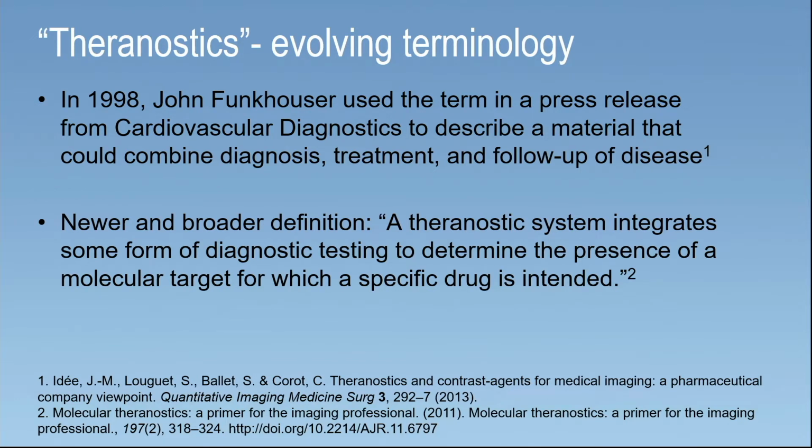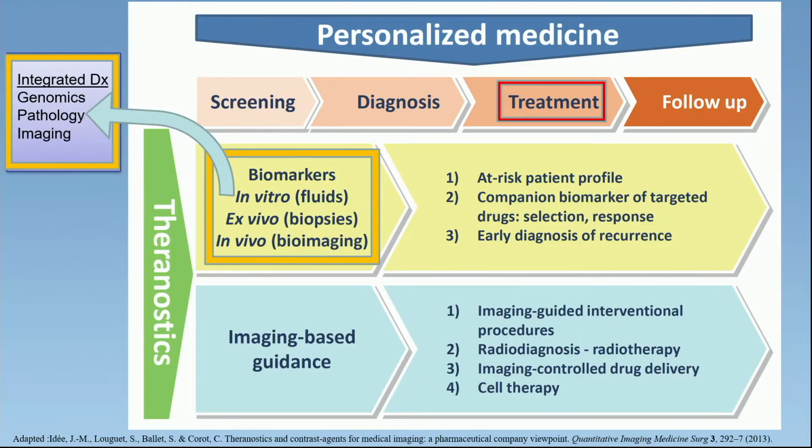There's a newer, broader definition that I kind of like, and it has more to do with imaging and nuclear medicine. A theranostic system integrates some form of diagnostic testing to determine the presence of a molecular target for which a specific drug is intended. And I'm going to work more with that newer, broader definition. So in this classic keyhole approach to a talk, I'm going to first start with a broader overview of where theranostics really fits.